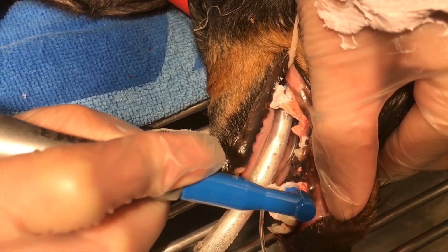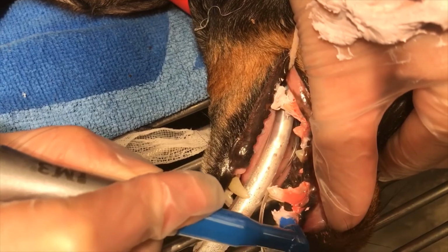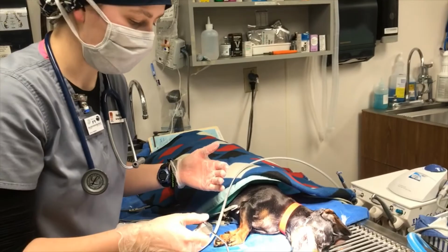Just do nice gentle movements back and forth, moving from tooth to tooth to maintain the proper amount of contact time. Go. Alright, after we've prophied, you also do want to go ahead and rinse out the mouth.